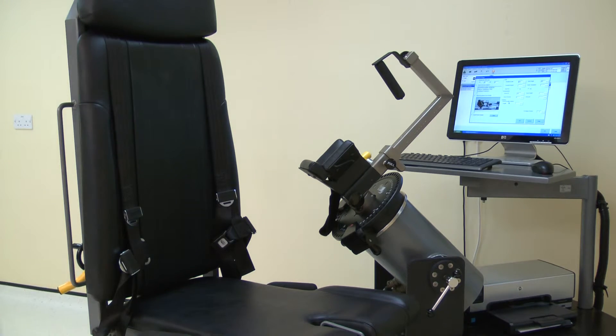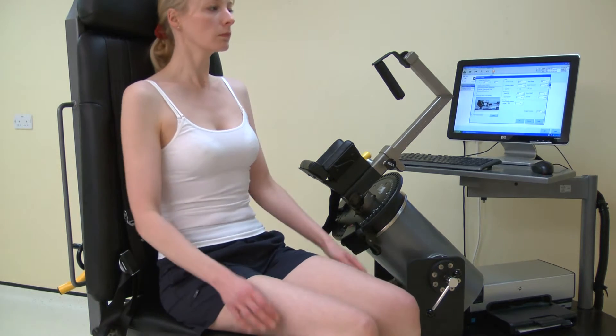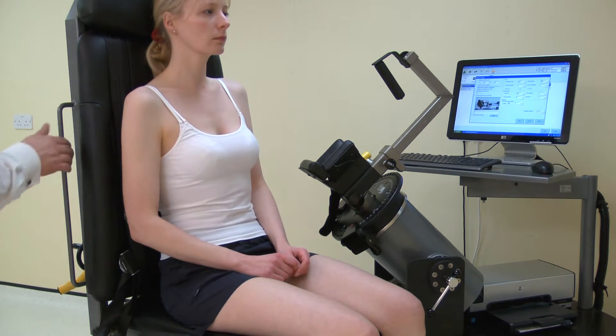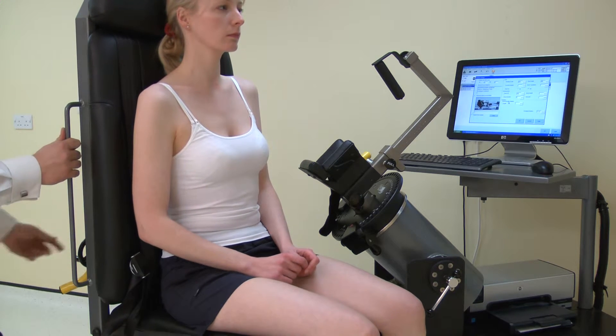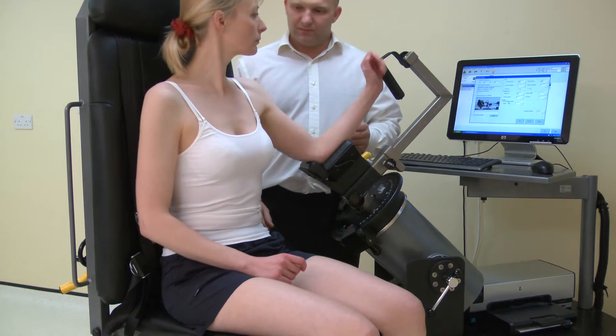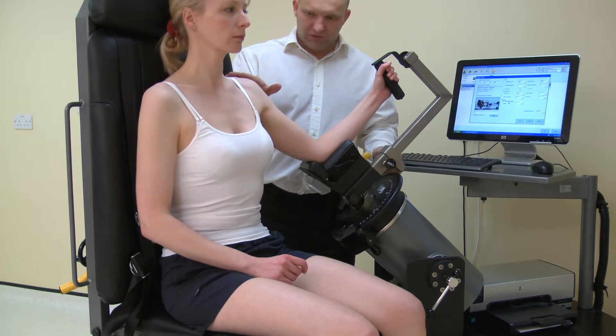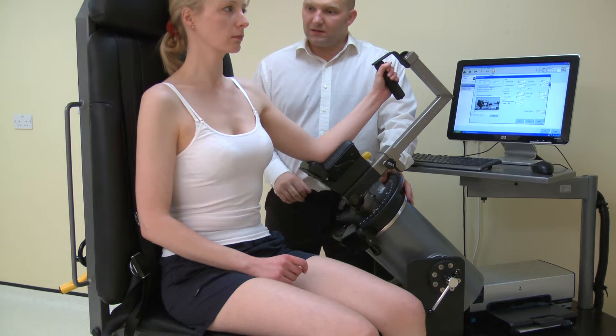Once the norm is positioned, ask the subject to sit on the chair. Adjust the chair back translation for comfort. Place the elbow into the stabilizer. Then adjust the dynamometer height to ensure the shoulder is in a neutral position — not elevated or depressed.